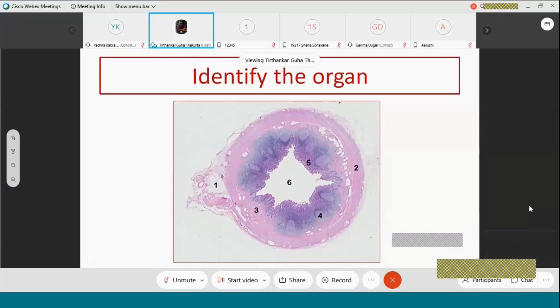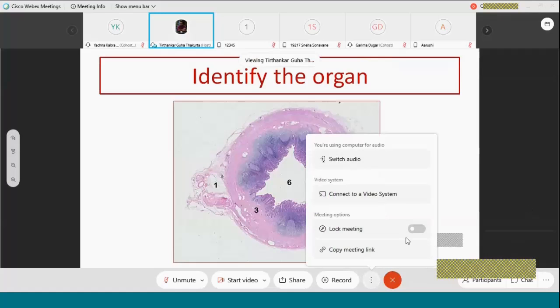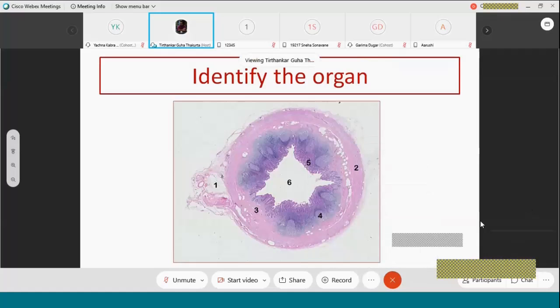Goblet cells cannot be present beyond the submucosa. If a columnar epithelium or gland or goblet cell is found in the muscle layer, except for some special situation, it always represents a cancer or an adenocarcinoma, because glands are not present in the muscle layer, except for some histological aberrations that I'll discuss later. In general, it means it is an adenocarcinoma. So you should not get goblet cells in the muscle layer. These are adipose cells, and fat is normally present in between the fibers of smooth muscle.